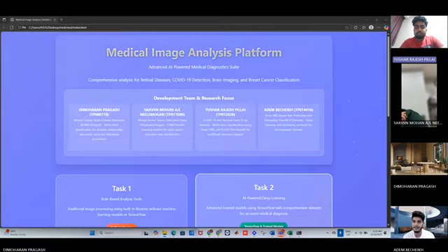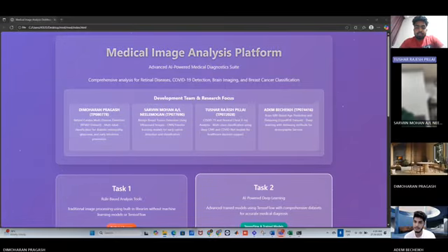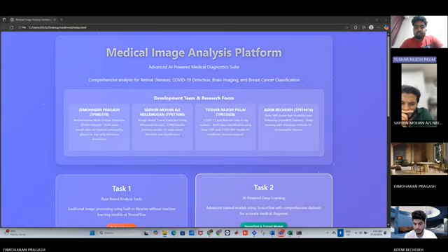So, hi everyone. I'm going to talk about the COVIDNet project and GUI. Today I'll be presenting COVIDNet based chest X-ray classification together with our custom GUI interface to make the system usable. Starting with topic number one, that is motivation, the problem statement.